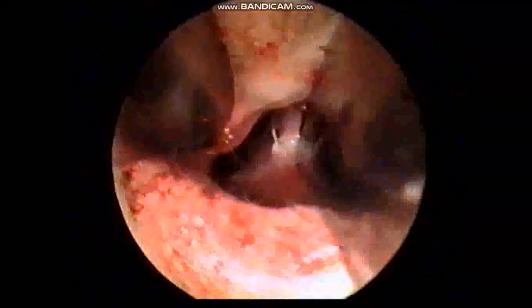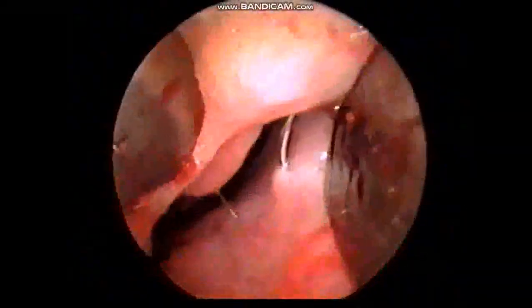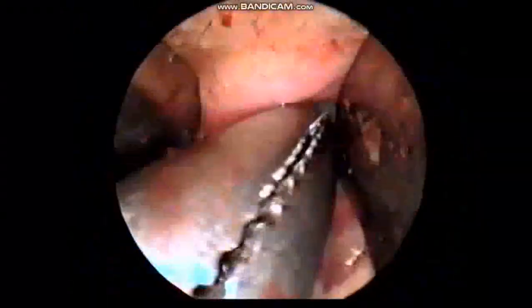Using a 2-0 or 3-0 catgut, you fix the mucoperichondrium of both the sides to the cartilage. Take a bite from one side. Bring the needle from the opposite side. There you can see the needle on the other side of the nasal cavity. Through and through, from the mucoperichondrium of one side, then the cartilage and the mucoperichondrium of the opposite side. Bring it out.